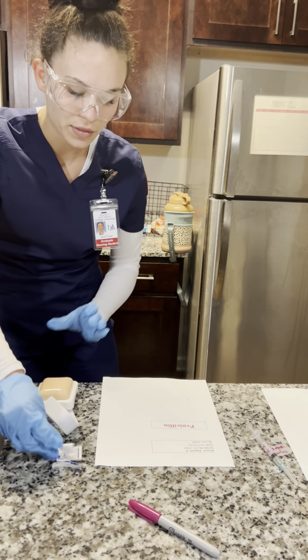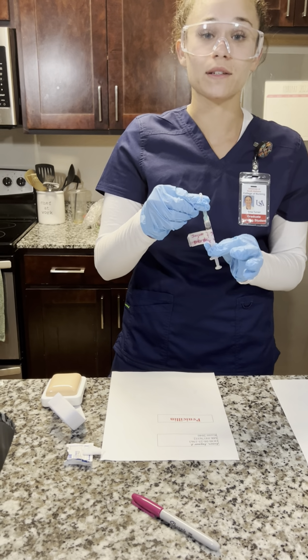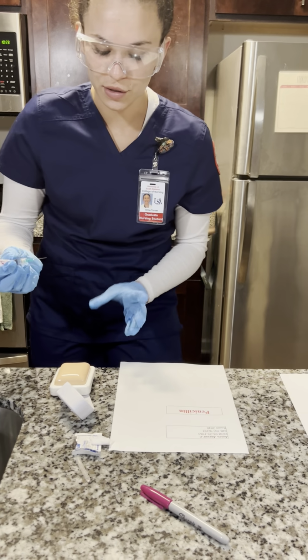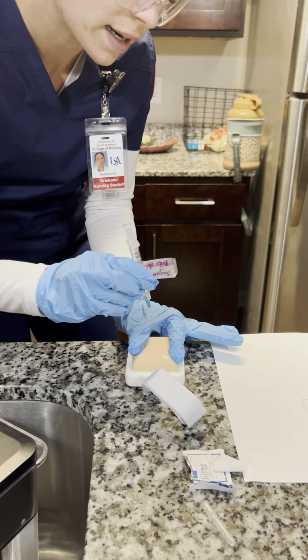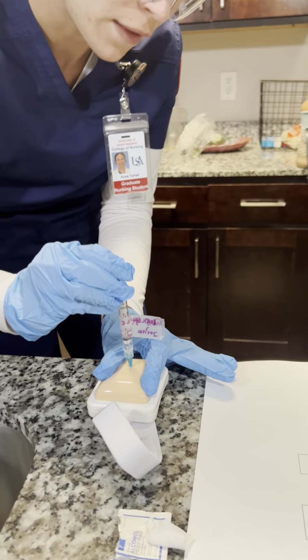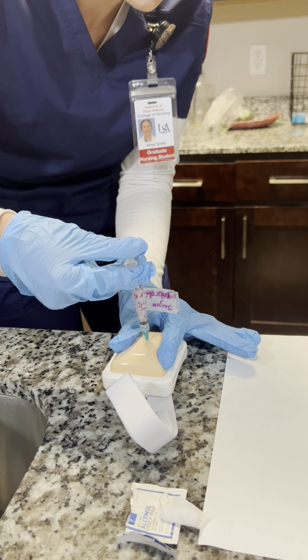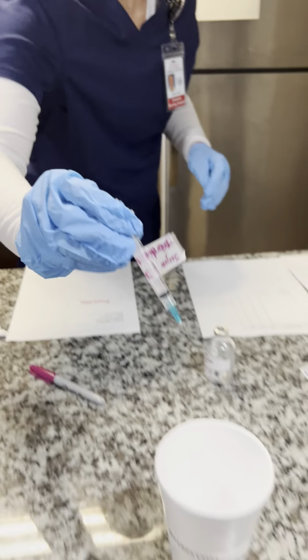Okay, and now that I'm done with that, I'm going to grab my syringe. I'm going to take the top off of my syringe. Okay, I'm going to spread the skin, since this is intramuscular and morphine. I'm going at a 90-degree angle. I'm going to aspirate for blood, and there is none, so I'm going to slowly inject the morphine. And I'm going to pull this out. I'm going to put this into the sharps container.